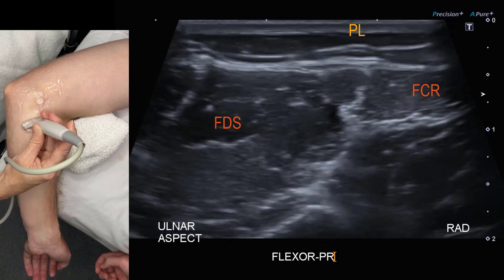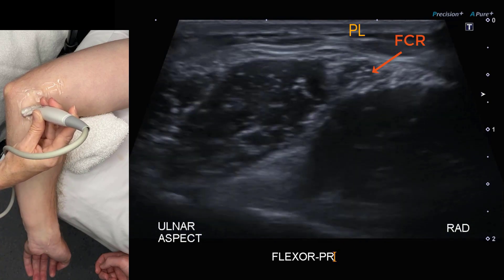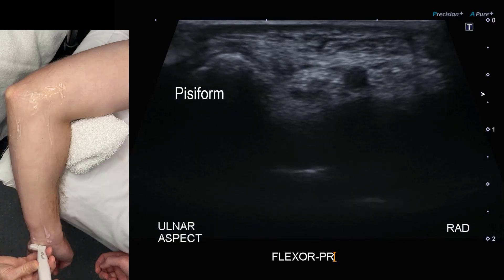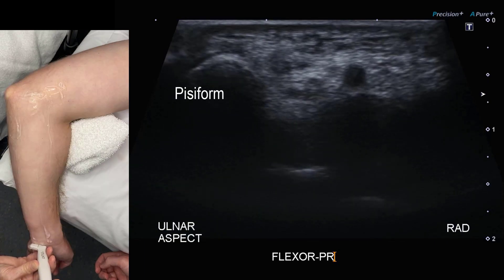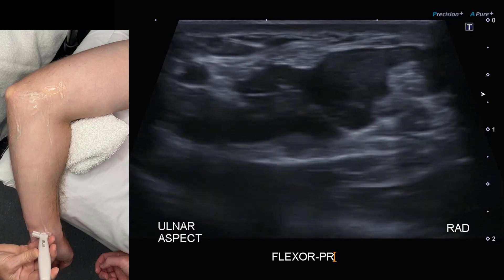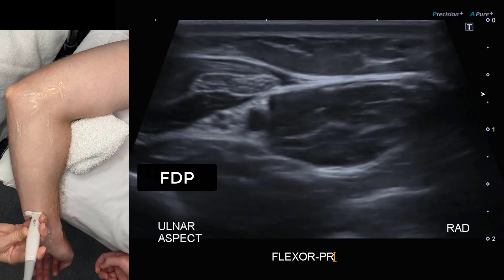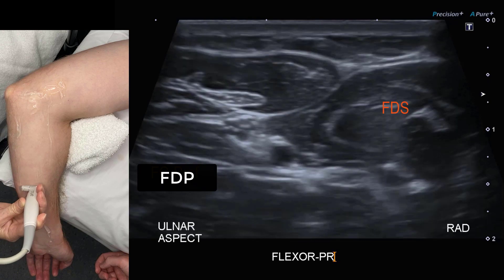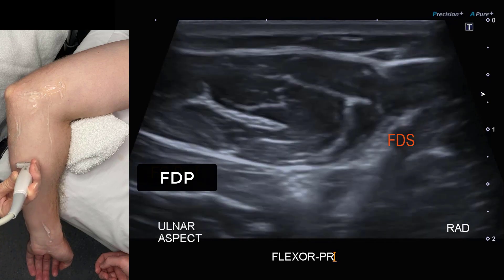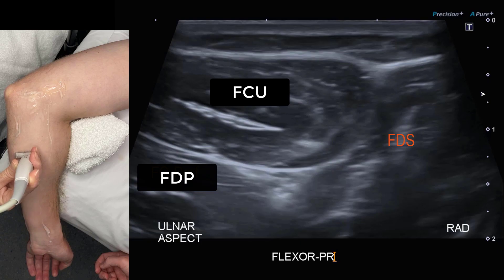Let's examine the component tendons of the common flexor origin. There are multiple, and we can start with a transverse sweep — if you're new to this — over the ulnar nerve and over the ulna, coursing up the flexor carpi ulnaris. It has a distinct appearance in the proximal forearm because it has two heads.